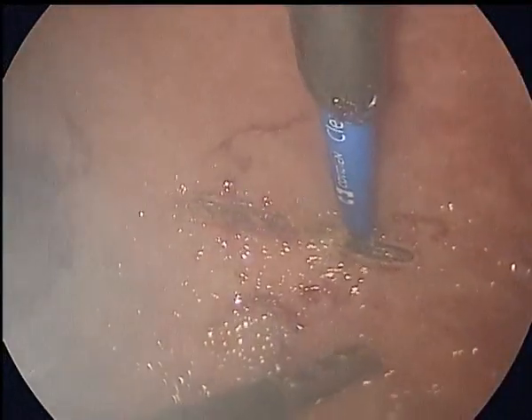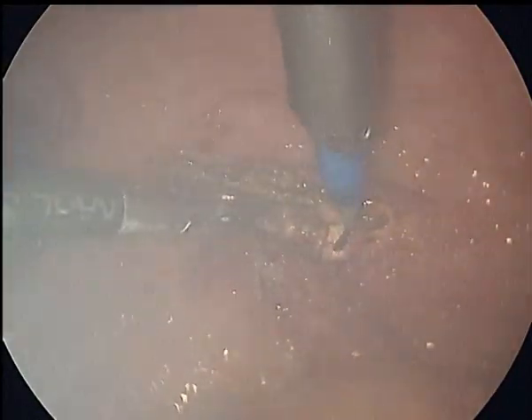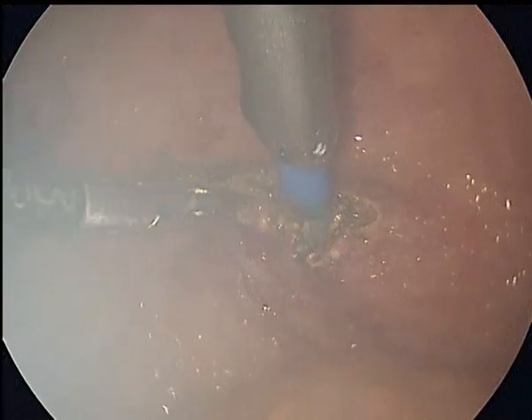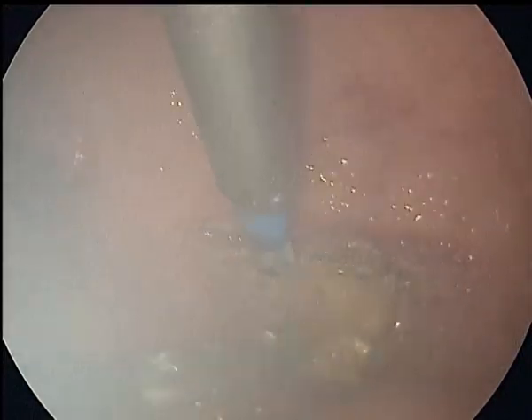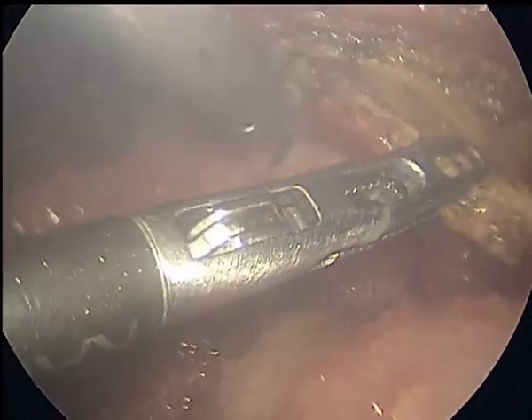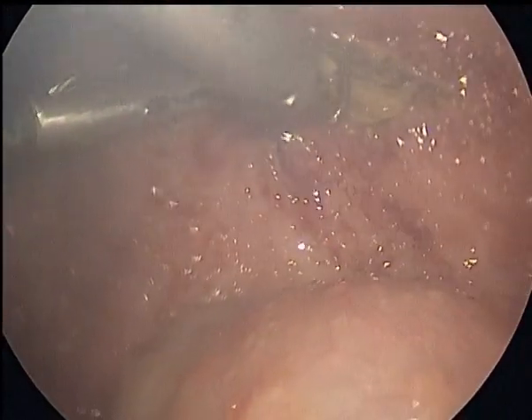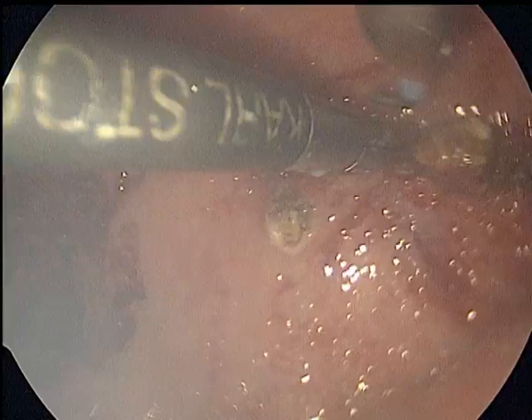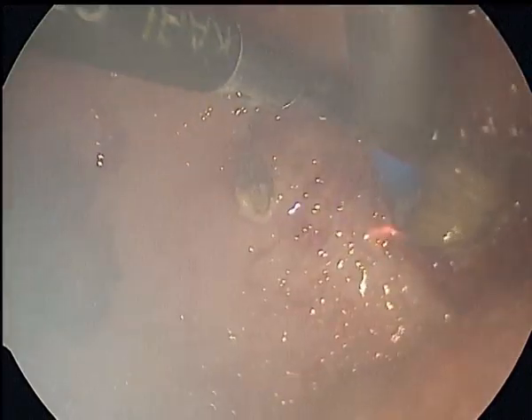Here we are using our monopolar cautery, and we give traction with our grasper, and we are separating the peritoneum from the underlying tissue. Monopolar is a very good instrument for this type of peritoneal biopsy, rather than going for only a punch peritoneal biopsy, which may be incomplete because the specimen will be very small.